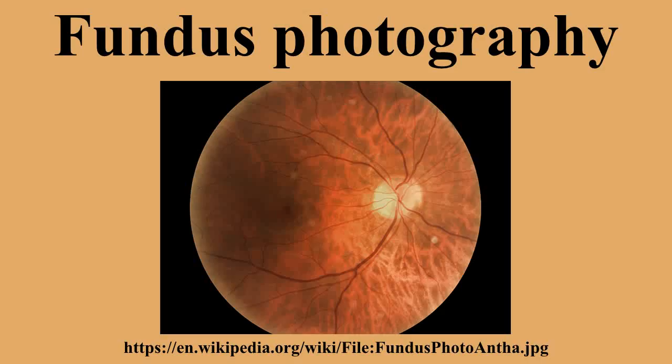Advantages and disadvantages. The retina consists of 10 semi-transparent layers that serve specific functions in the process of visual perception. Fundus photography provides a bird's-eye view of the topmost layer, the inner limiting membrane, as well as the other underlying layers. As retinal abnormalities often begin in a particular layer of the retina before encroaching into the other layers, it is important to be able to appreciate depth when examining a fundus in order to provide an accurate diagnosis.